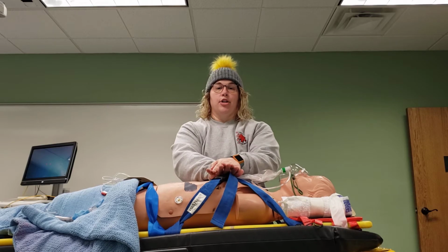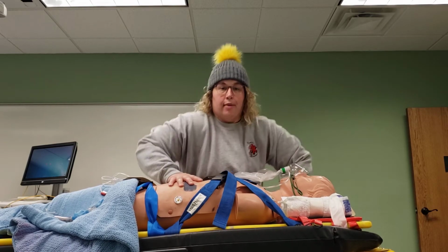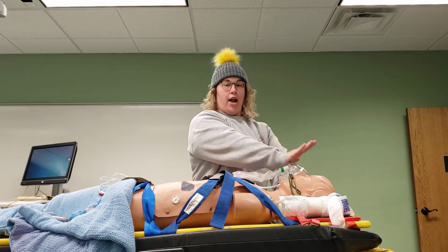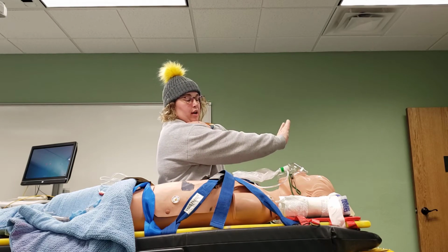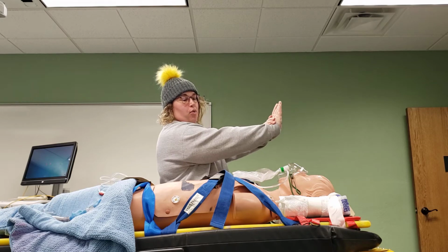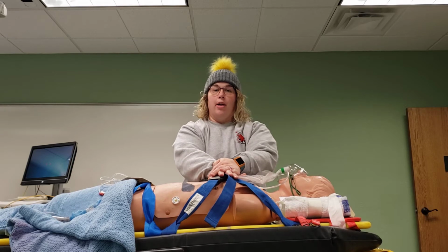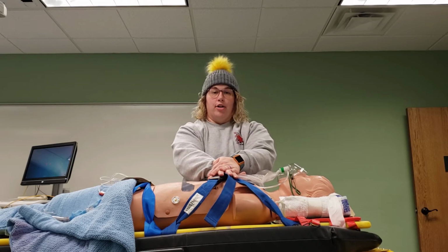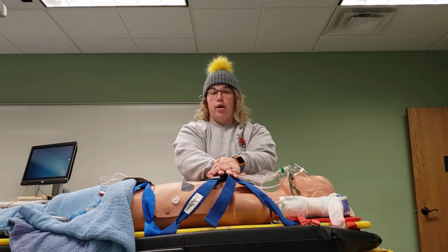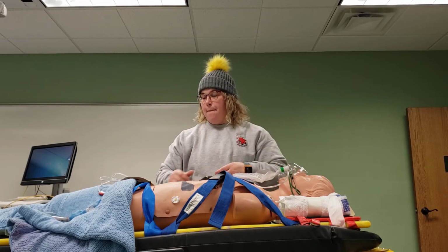I'm doing my compressions. Now, as you can see here, this cot is too high for me. I should actually be in a position like this so I can lean over the patient, get my arm straight, and my goal is to have an arm that looks like shoulder over wrist. So that'll give you a firm support. If you try to do compressions like this, you're not going to be able to put your body weight behind it, and you're not going to get a lot of pressure down on the chest. So you want to lower the patient as appropriately, or do it on the floor. Take him off a bed because you're just going to be collapsing the bed.